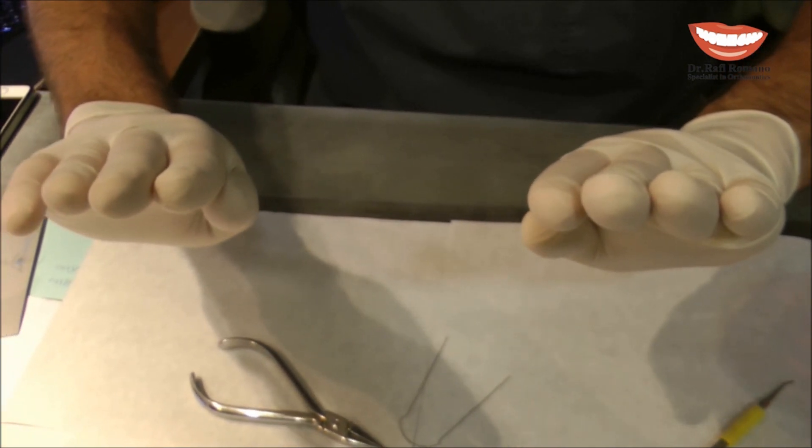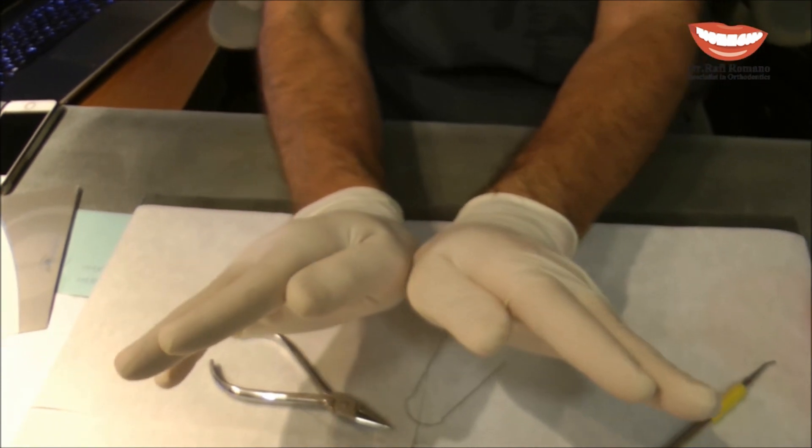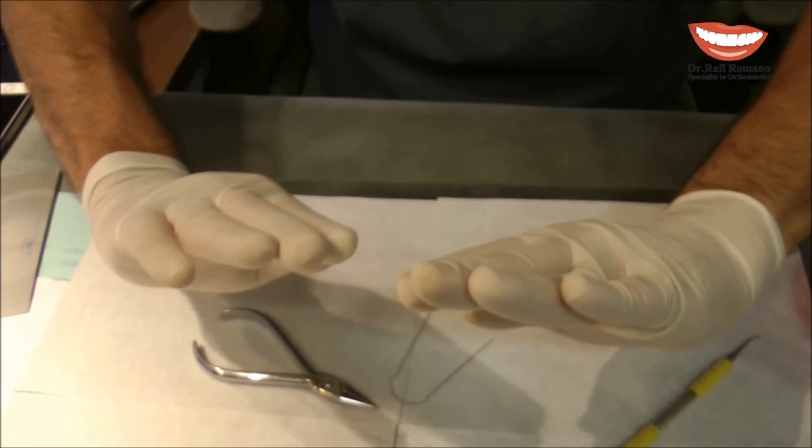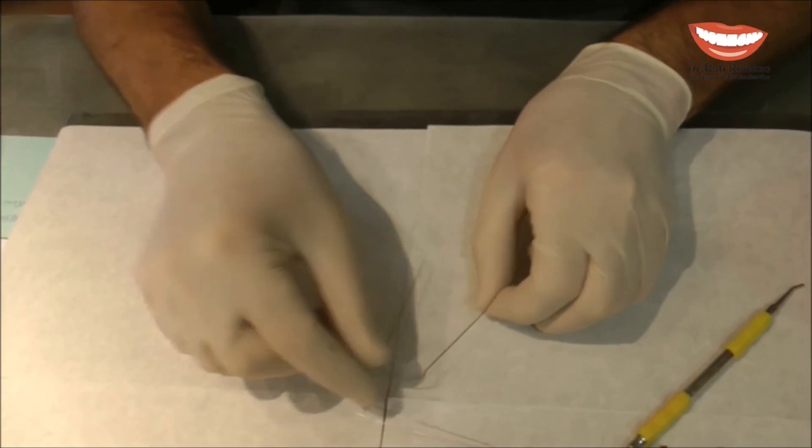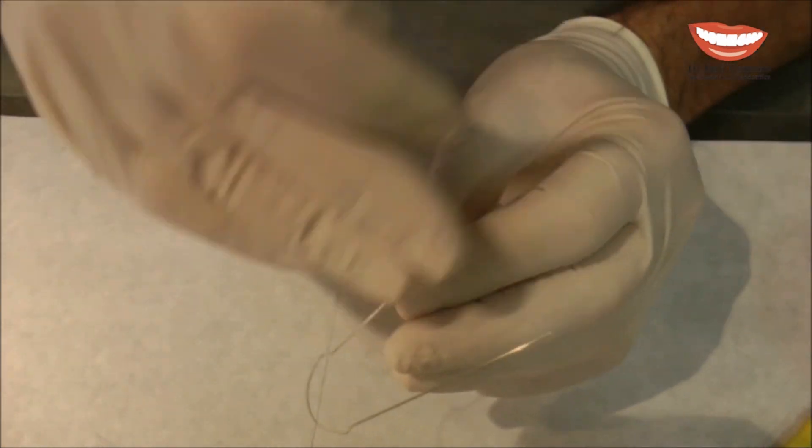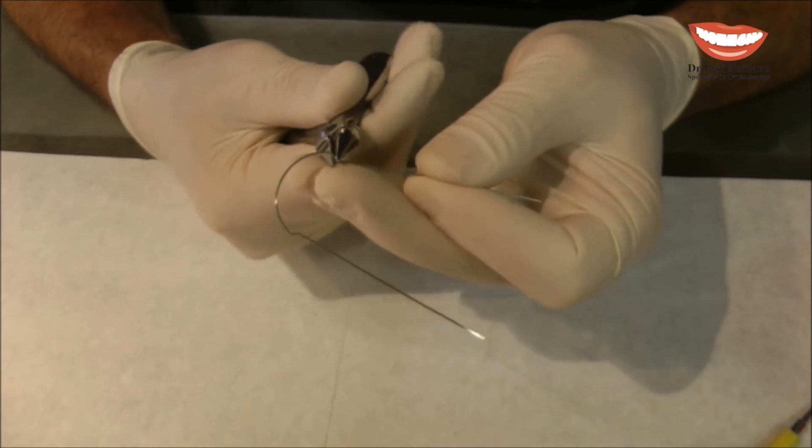We want to avoid the tendency for the teeth to tilt and that's why we will make an opposite band in the wire. So this band should be made both in the horizontal and in the vertical. So that's the way how we do it.